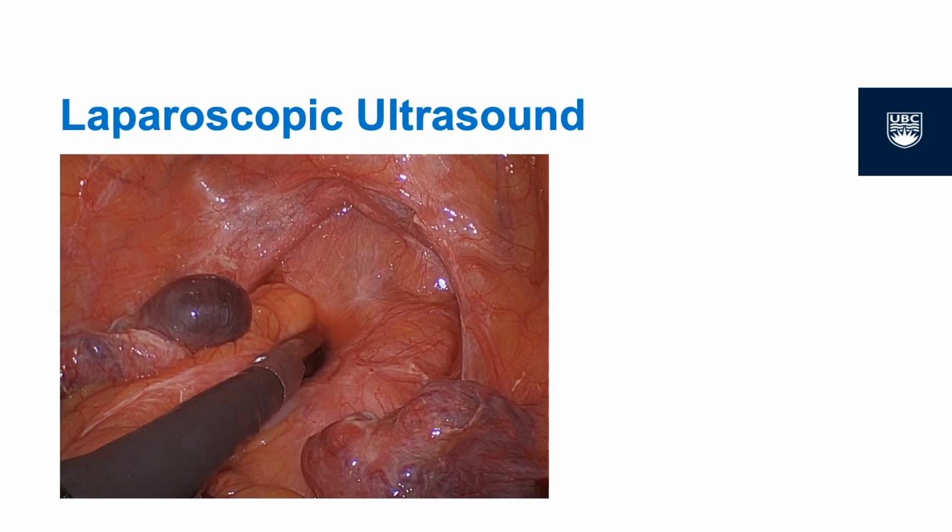Initial surgical planning in the setting of deep endometriosis often relies on preoperative imaging. However, distortion secondary to high-stage endometriosis and adhesions can lead to inaccurate estimates of the size, depth, and concurrent organ involvement of these lesions. With this, surgical teams are often forced to rely upon tactile response and intraoperative decision-making to determine how best to proceed in the management of deep endometriosis.